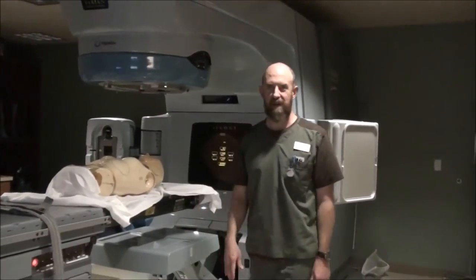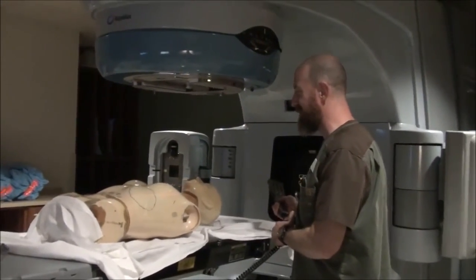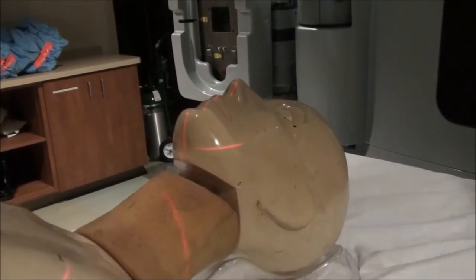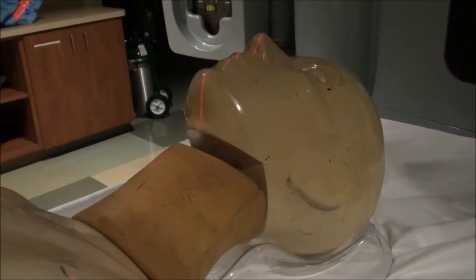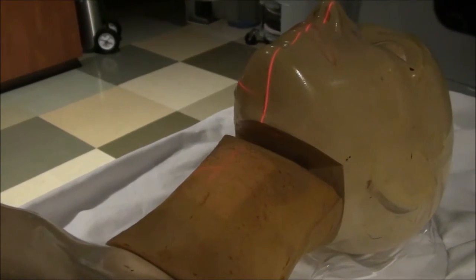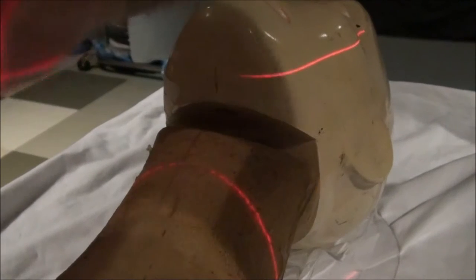We don't need arm pullers on her. We're going to center such that this little slope here is the top of the thyroid cartilage, and this piece out of the foam is the cricoid cartilage. I'm going to shoot halfway in between one and the next, then close my field size down to encompass that. The field sizes tend to be about five by five to six by six — I'm going to make this five by five.